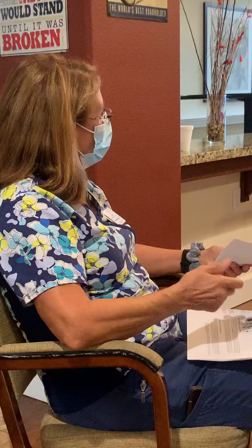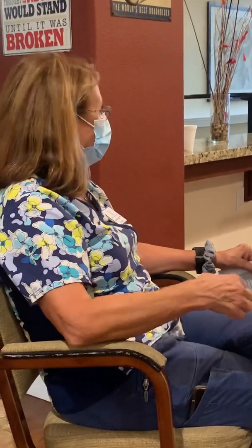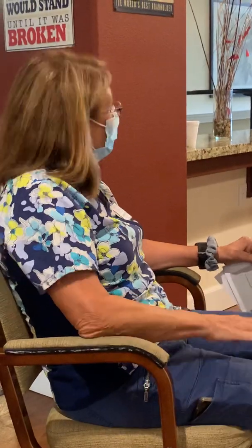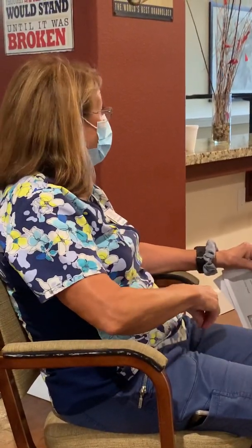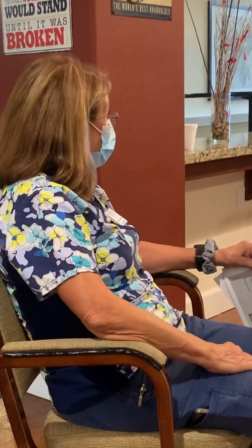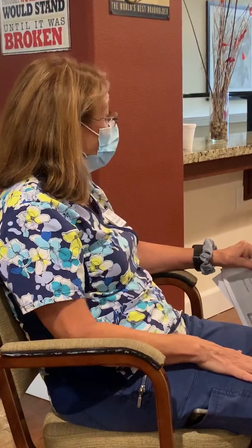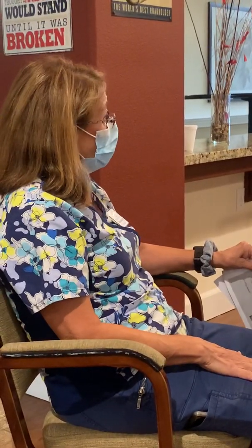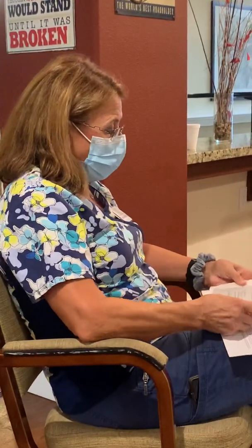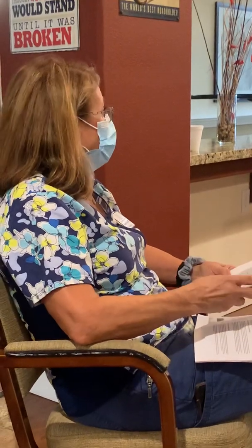So if they have what they call the stat lock, which is mostly for male patients, that way there's not a drag on their penis, make sure that it's locked well and that you have some slack between the end of the penis and that stat lock that's on their legs. Also, after a few days, you may want to remove that stat lock because it can do damage to that tissue underneath it. So it should be removed. Then also, is the bag empty, full? Make sure that you keep it clean.